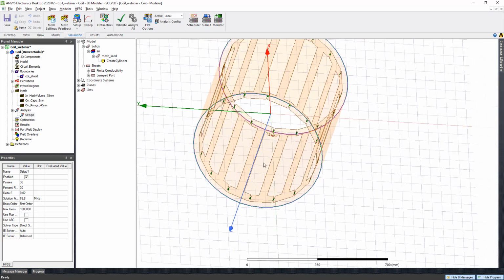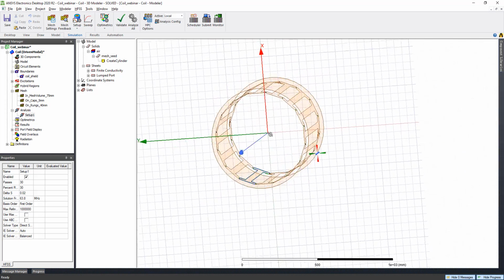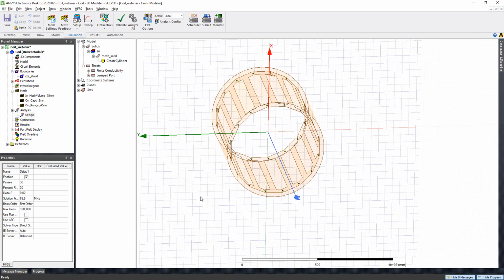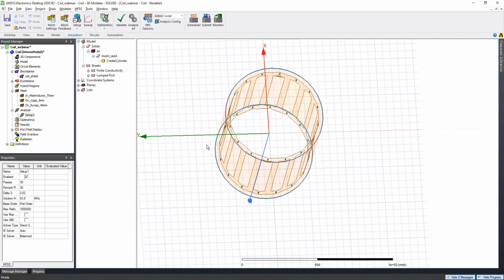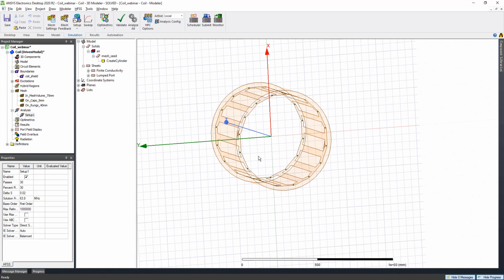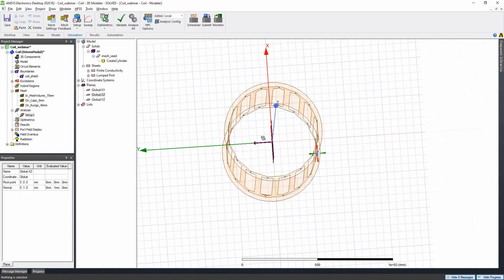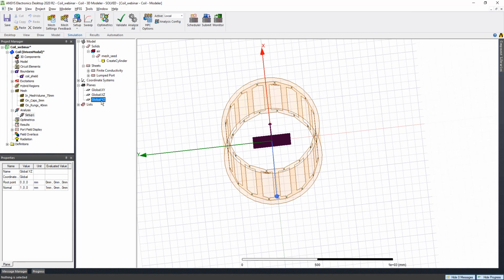Because of timing issues, I am cutting this short. I already simulated this design, and we can go ahead and look at some results. The first thing we want to verify is how your MRI coil performs. There are a few things we typically look at. First, of course, we look at the field. We can look at the magnetic field, and we can look at the electric field.